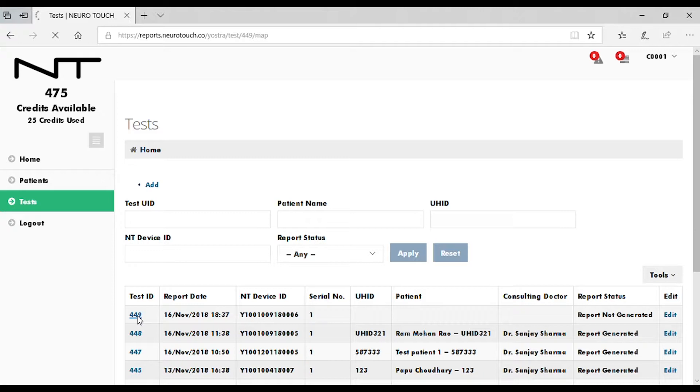To assign test data to a patient and generate a report, click on the respective test ID.